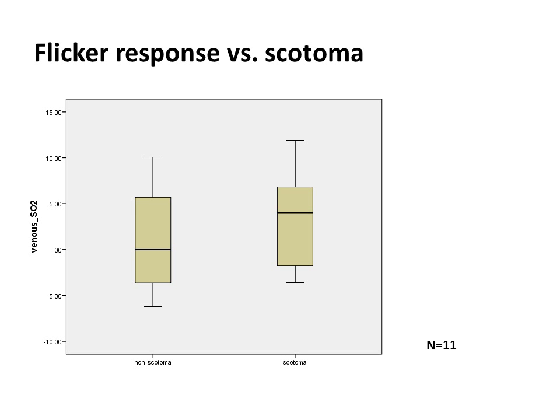Up to now we have 11 subjects in the study, and you see that there is virtually no change of the venous oxygen saturation by the flicker in the non-scotoma area, but in the area of the scotoma we have about a 3% increase of the venous oxygen saturation.